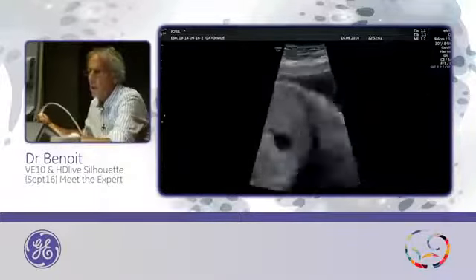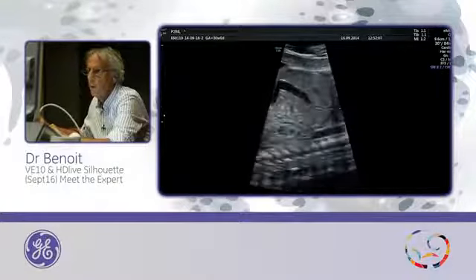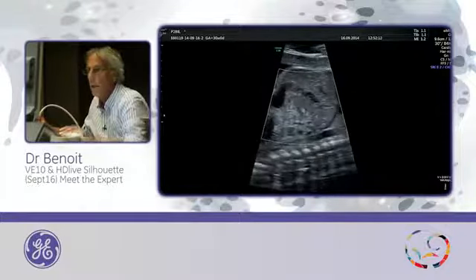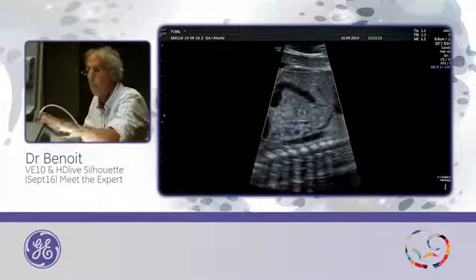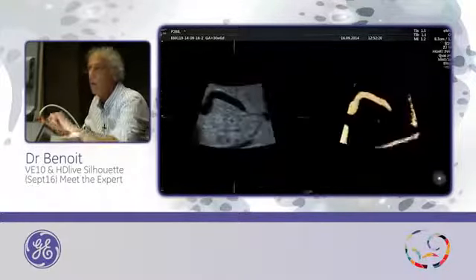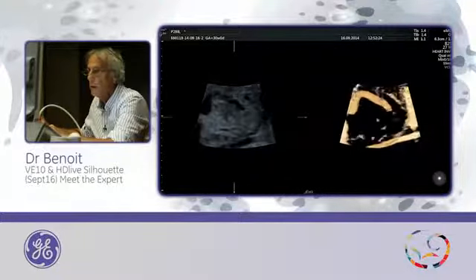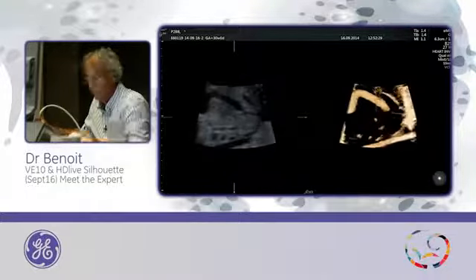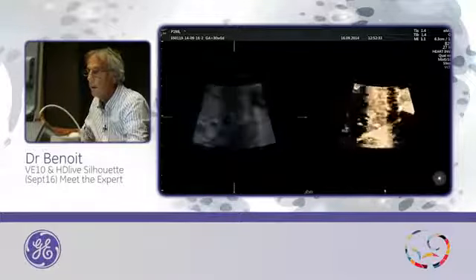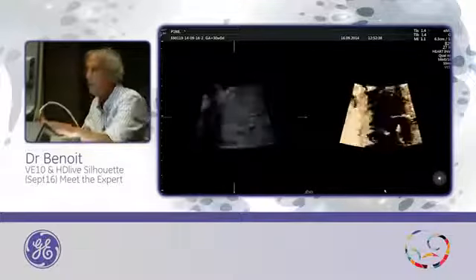Okay. I will do it here. This is the umbilical vein with the same VCA A-plane with inversion mode. Start. Umbilical vein. And now I will decrease the gain. And when I decrease the gain, you can see here ductus venosus. Here. So you can do examination of all the vessels with this method.